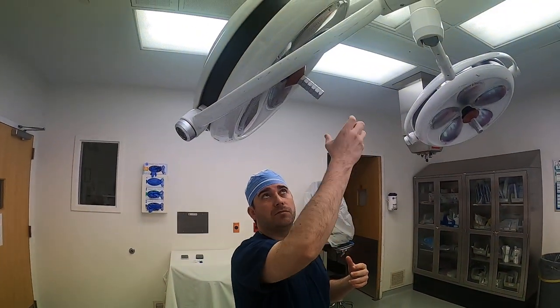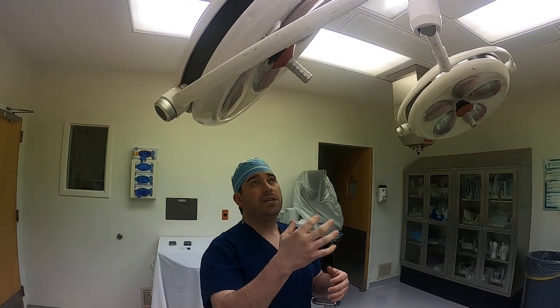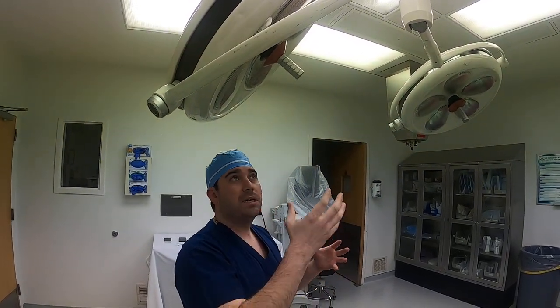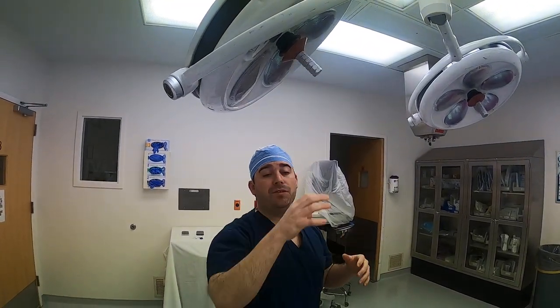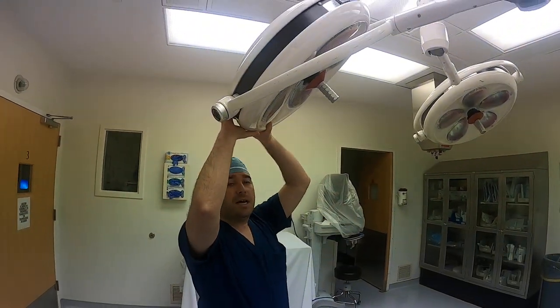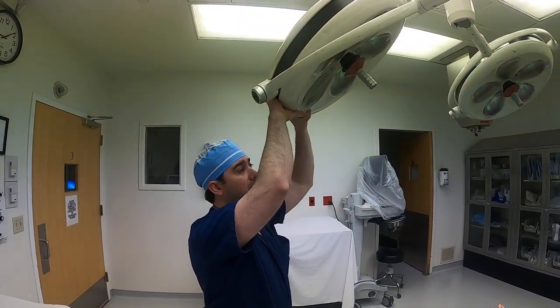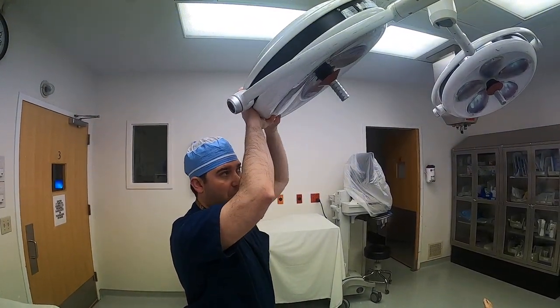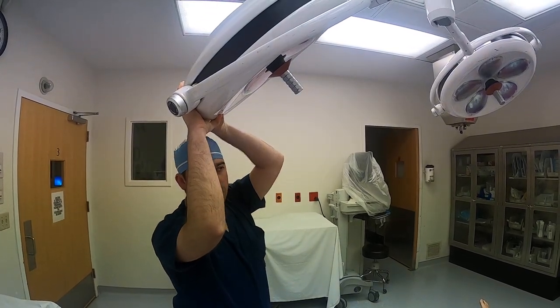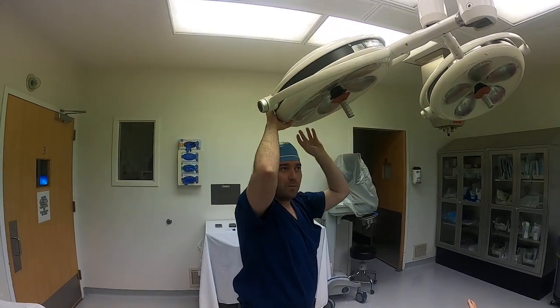After the case is prepped and sterile, the light handle gets a sterile cover — at that point, a non-scrubbed student can no longer touch that portion. If you are scrubbed in, use the sterile handle to move the light for the surgeon. If you are not scrubbed, you can grab the light by the non-sterile portion — preferably the back or sides — and move it as needed. For example, if the incision goes from medial to lateral, moving the light saves the surgeons one extra step.